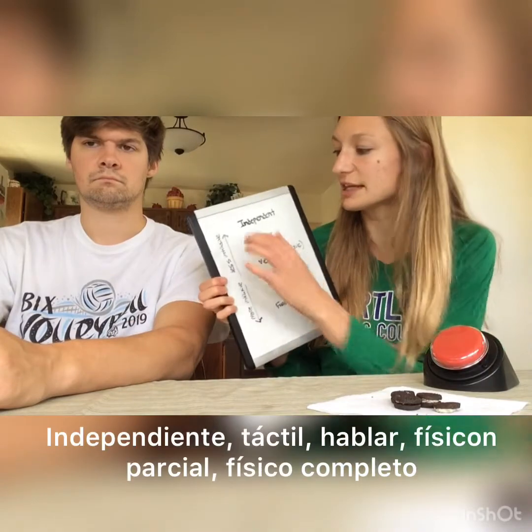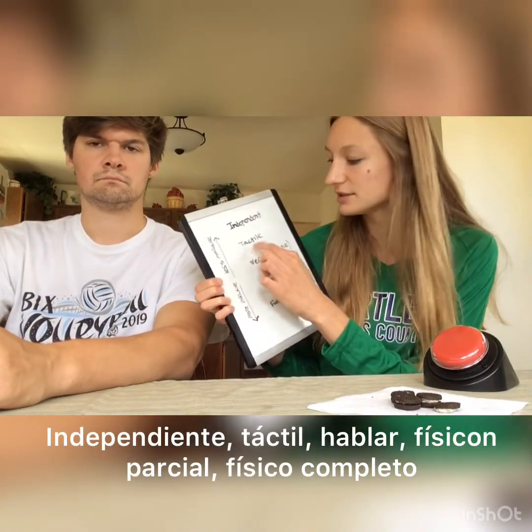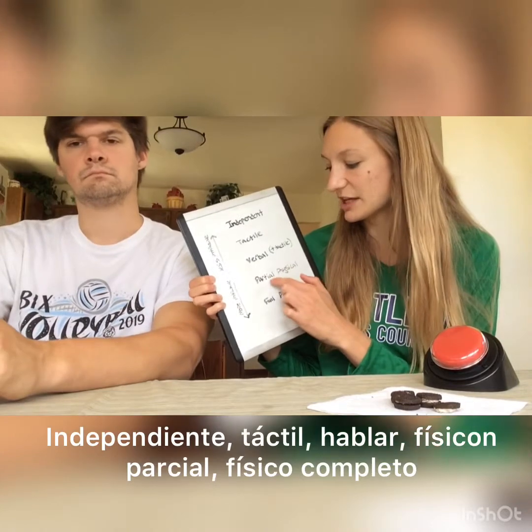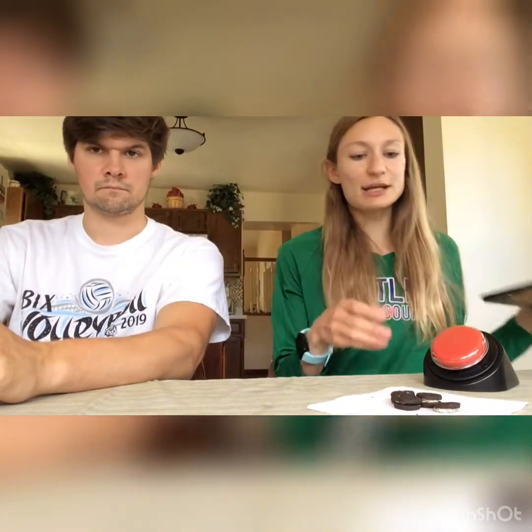So we'll start with independent, then we'll move to something I like to call tactile, and then verbal, but usually when I do a verbal prompt, I'll add a tactile prompt in there too. And then we have partial physical and full physical. So let's demonstrate what independent would look like.